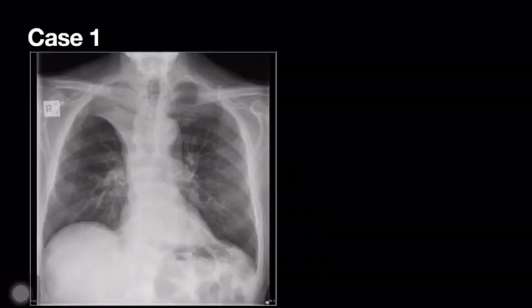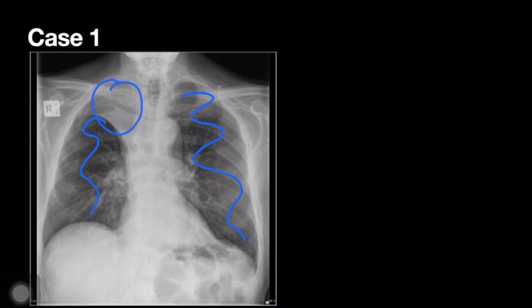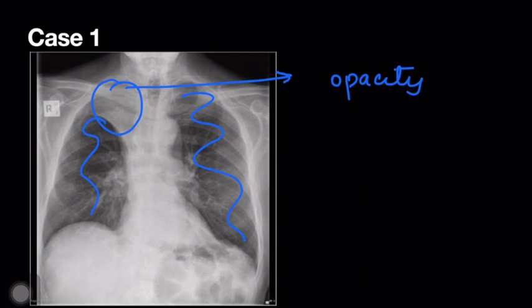So you have a radiograph — let's try reading it. What is the abnormality that you see? You can pause for a moment, look at it and come to a conclusion. Comparing both lung parenchyma, you can see the left lung appears fairly normal. On the right side, you can see an opacity — so there is a pathology in the form of opacity.